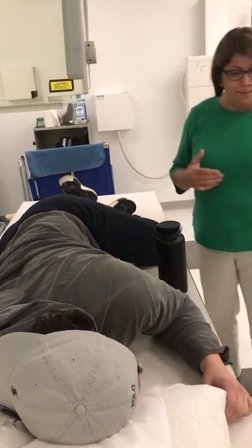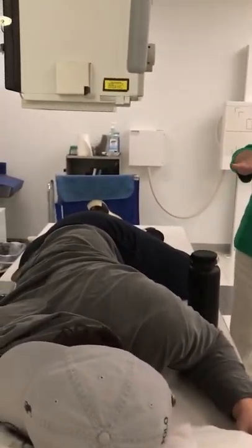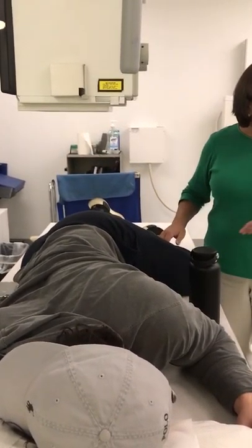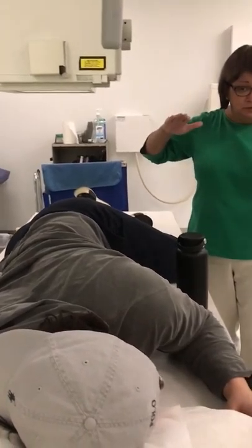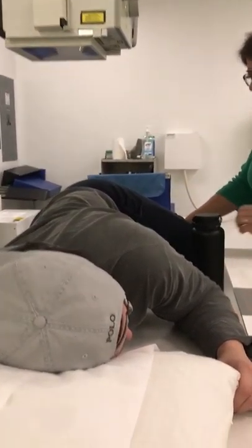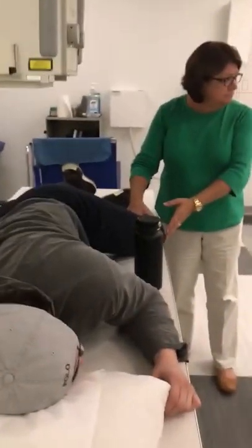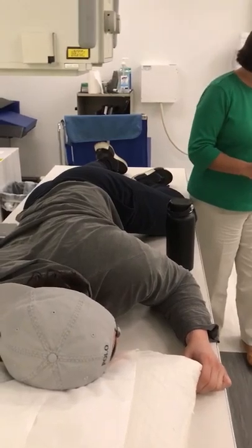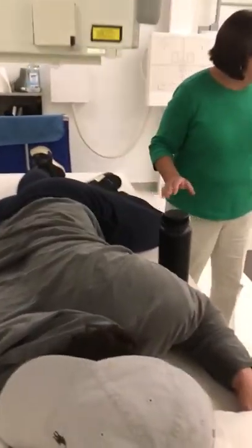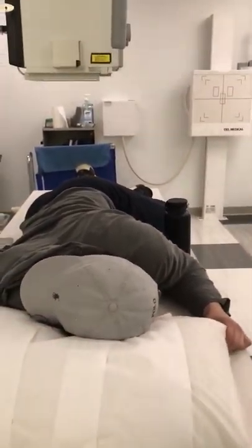Now, you want to make sure too that the shoulders are rotated the same degree as the hips. Now, I think his hips are rotated more than his shoulders. So I can control that. So I just grab his knee and I don't have to grab anyone behind. Just grab his knee and bring that shoulder, those hips down. I'm going to come to the head of the table.